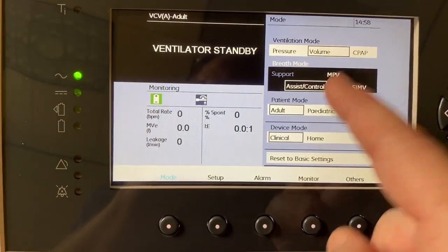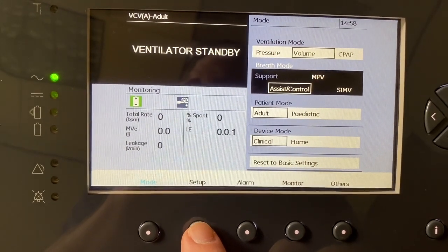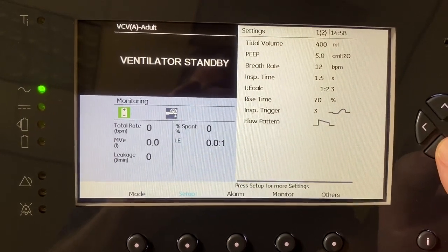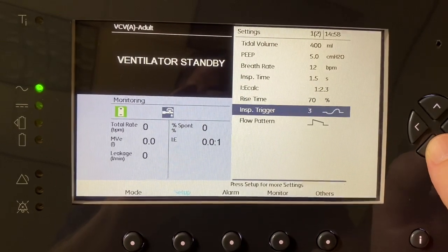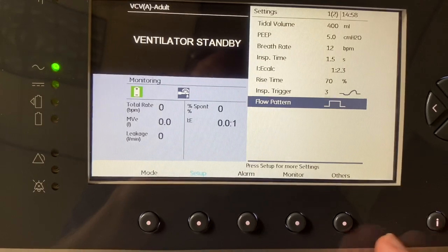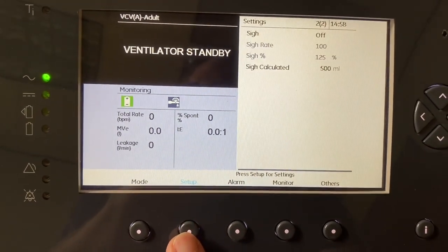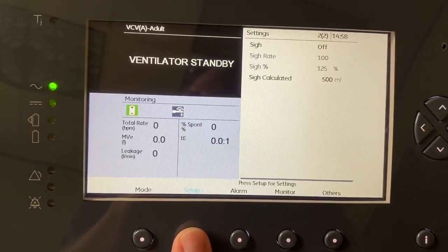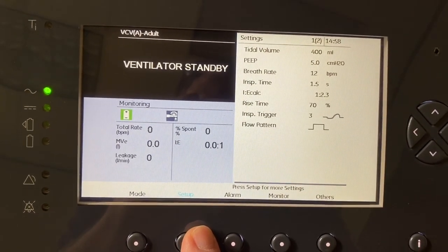I have my volume and my assist control. If I want to set certain parameters, I can click on setup. Here I can adjust my tidal volume, PEEP, breath rate, I-time, rise time, inspiratory trigger, and my flow pattern. If you press setup again, you will have more settings: sigh breath, sigh rate, sigh percentage, and sigh calculated. Press setup again and it takes you back to your original screen.